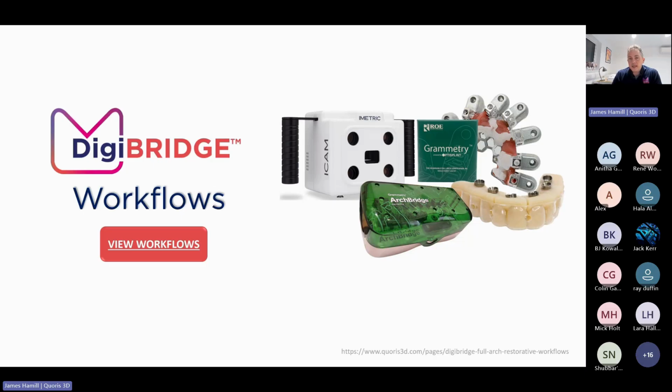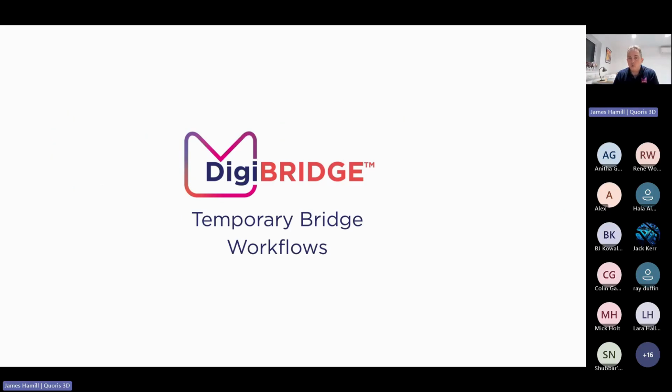So let's look at the various workflows that exist. So remember, there's 4 pathways, okay, and 2 workflows. And in each of the pathways, we've got the main, which is probably the most common, which is moving from a temporary bridge to a final bridge. And then the second workflow is moving from a temporary denture to a final bridge.